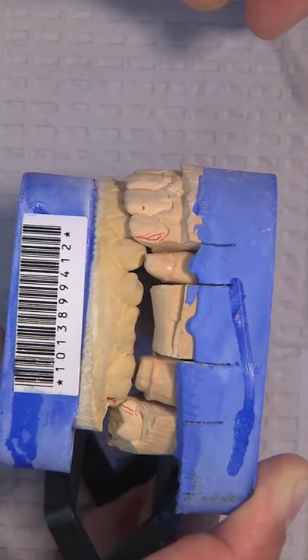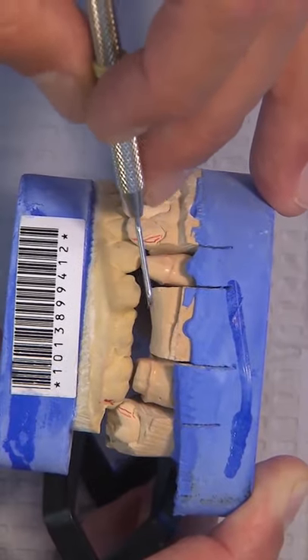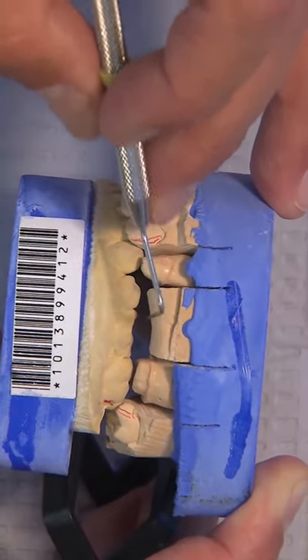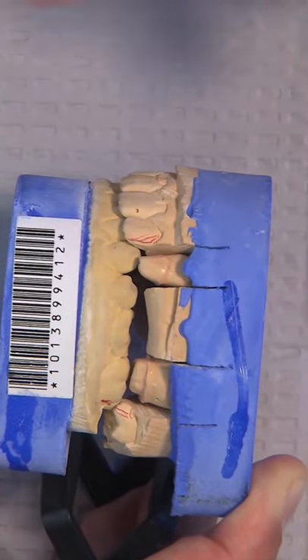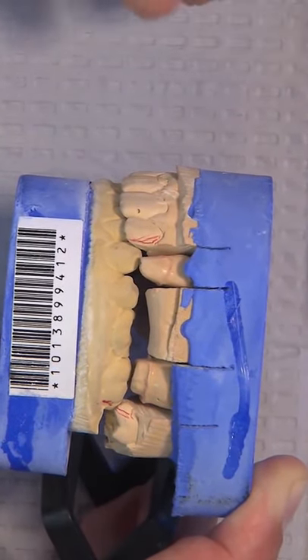27 violation and let him know that really without some soft tissue work being done here, which would probably include reducing the bone to be able to drop this far enough, that this bridge will not be able to be made as a BruxZir bridge and will need to be made as a porcelain fused metal bridge.